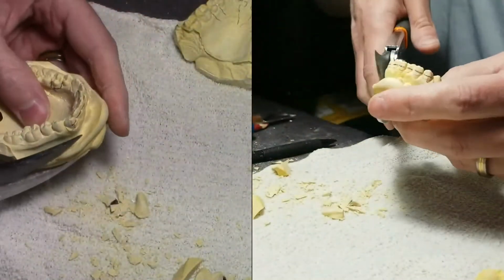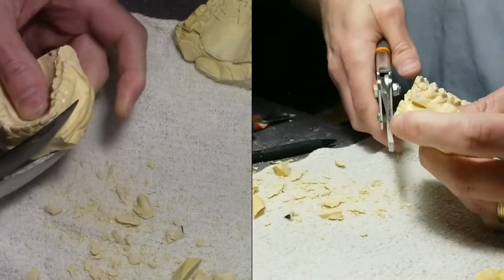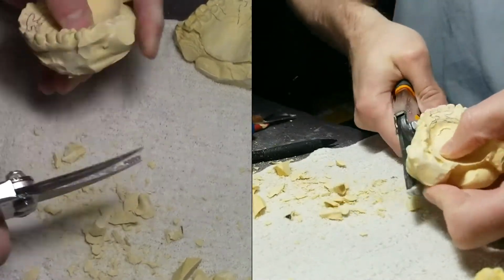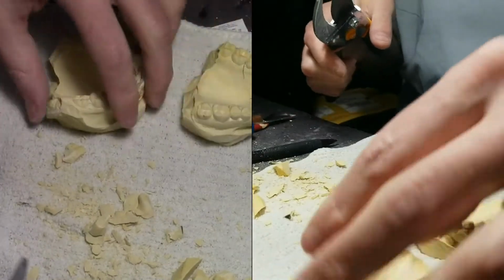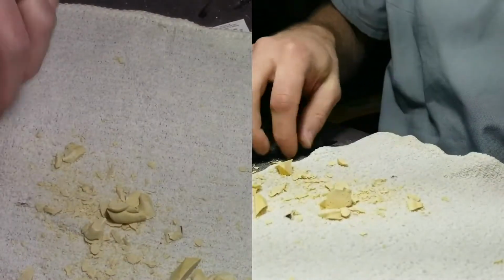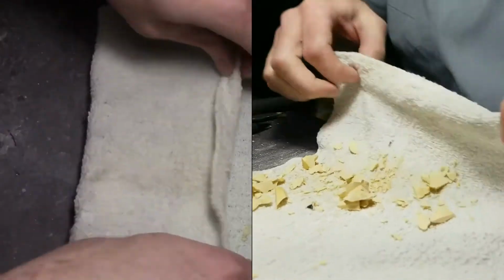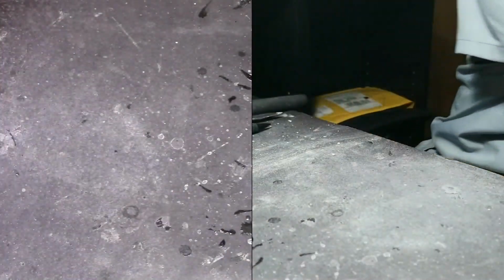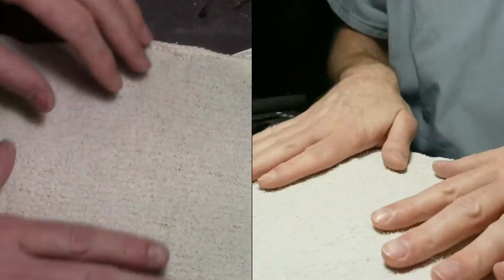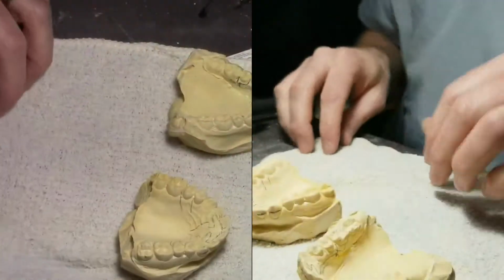So there's my quick little trim, so this fits in my model holder better. Alright, so I've trimmed them up. I got these cheap little dish rags, trying to keep it clean. I gotta buy a new black cardboard because this one's getting dirty on me. But anyway, so I got that all ready.